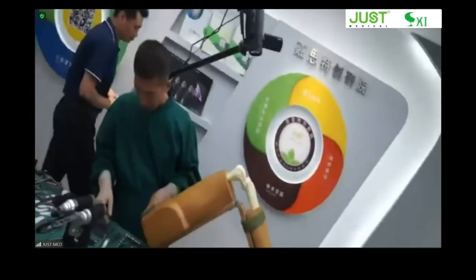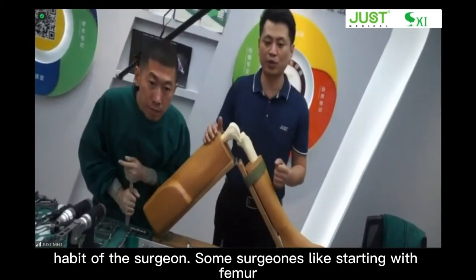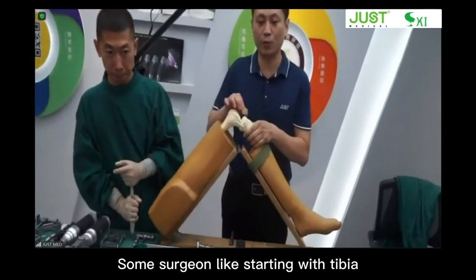Actually, it depends on the habit of the surgeon. Some surgeons like to start with the femur. Some surgeons like to start with the tibia.